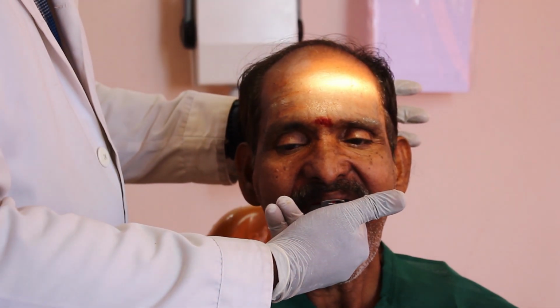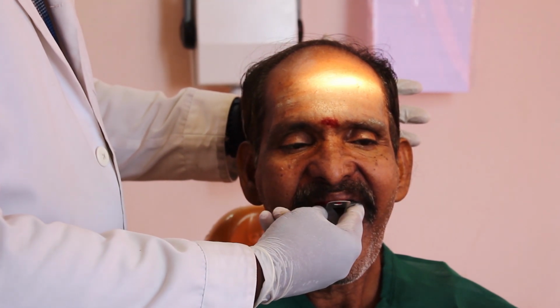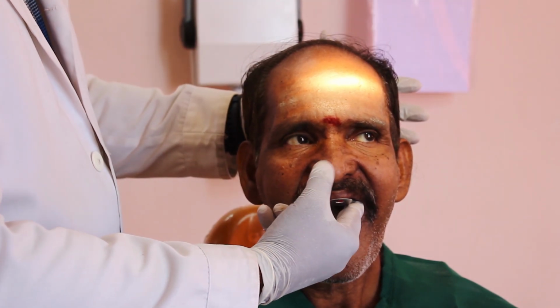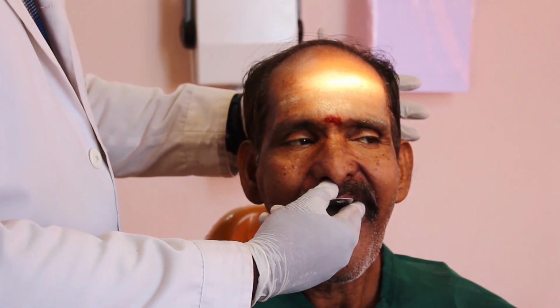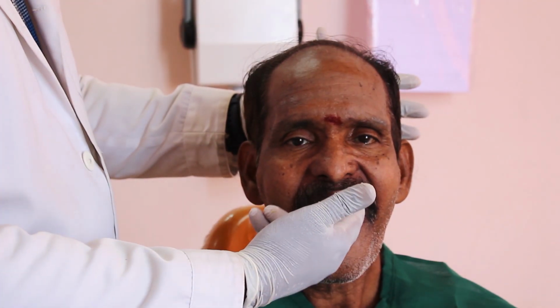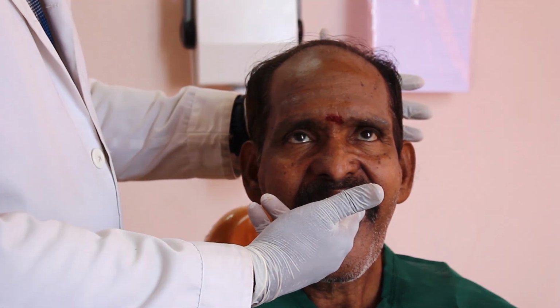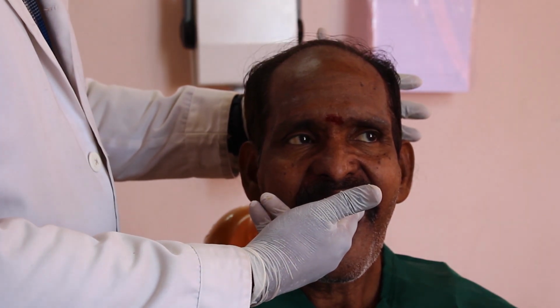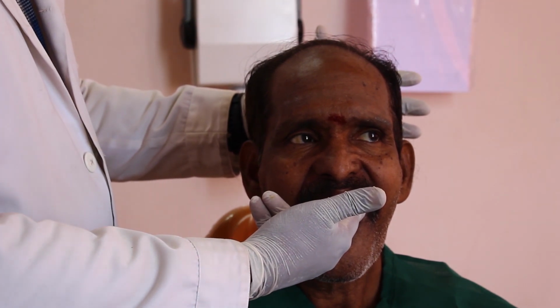Now we have to hold the tray in position to avoid distortion of the impression. We have to allow the impression material to set, that is, become rigid. The advantage of this impression compound is it allows for minor correction also if it is required in the deficient areas. But in case of irreversible hydrocolloid, we have to take multiple impressions to make a perfect impression.